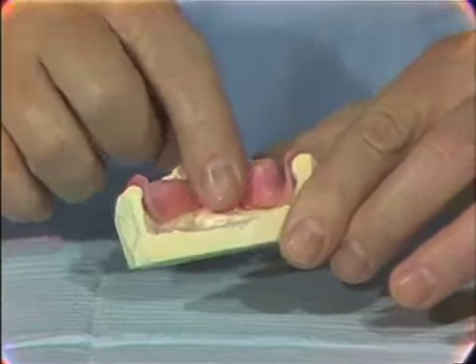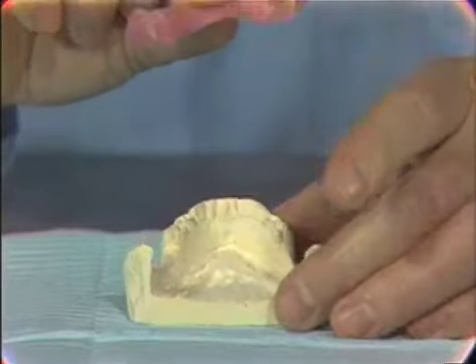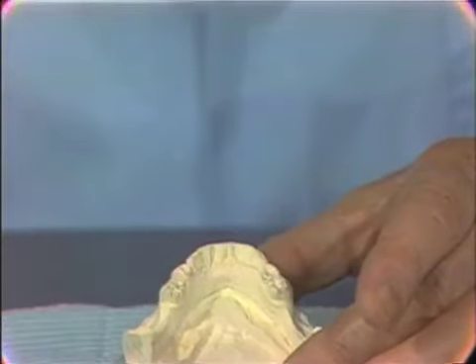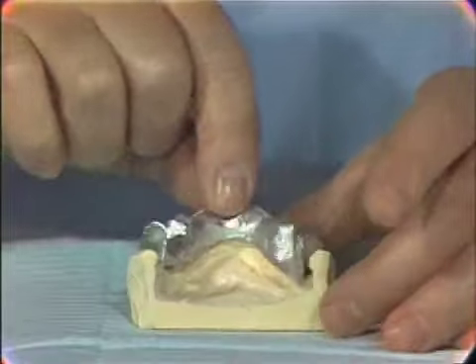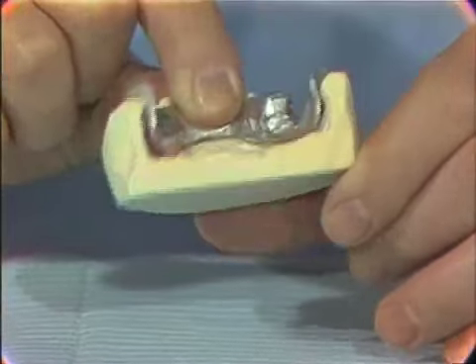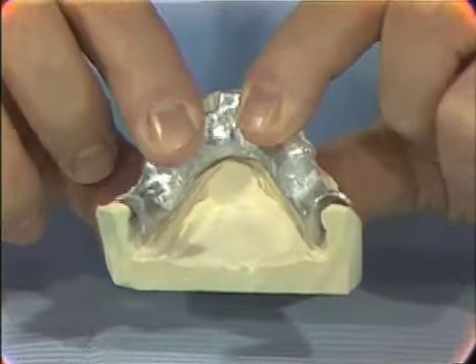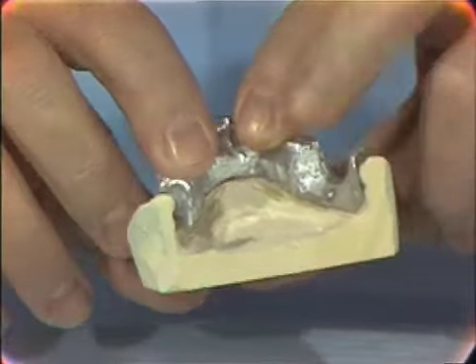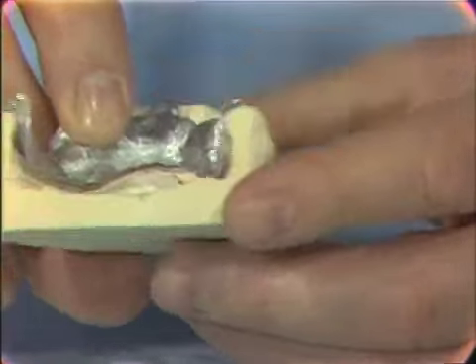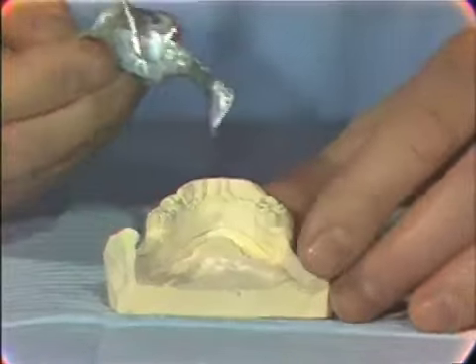So this wax pattern then can be cast in the aluminum material, and we wind up with a cast aluminum tray. And the stops that we would have on the teeth, and the space that we'd have between the ridge tissue and the tray to allow adequate escapement of the material once we place it in the mouth.